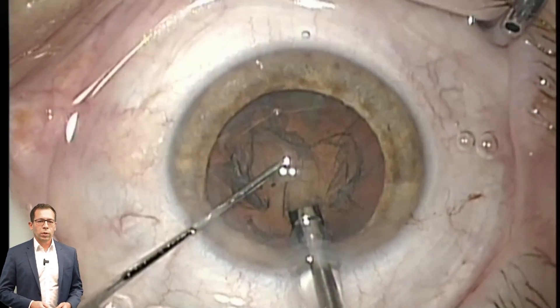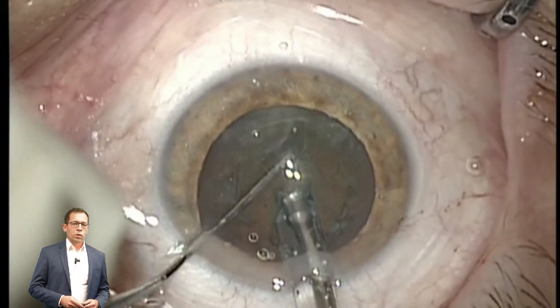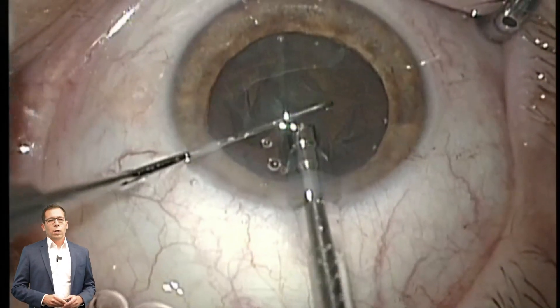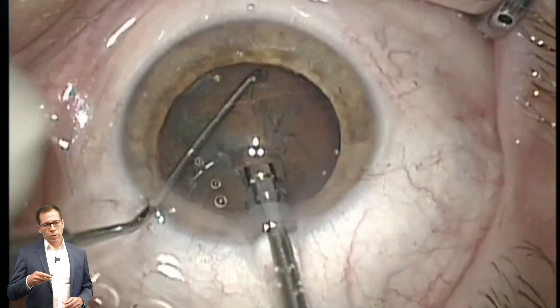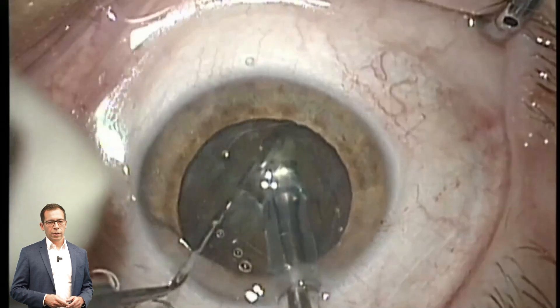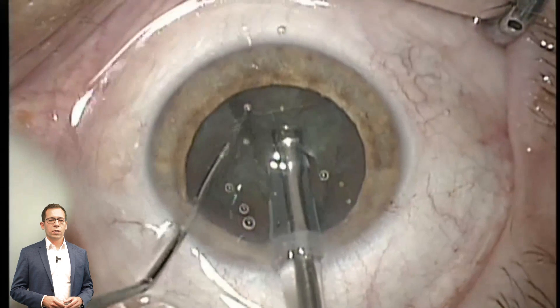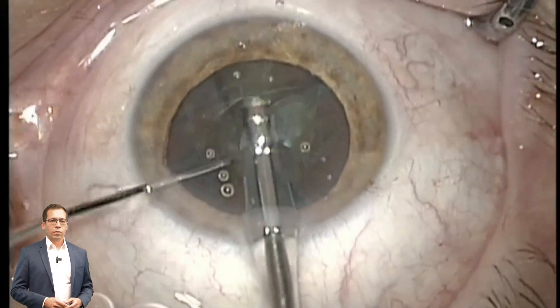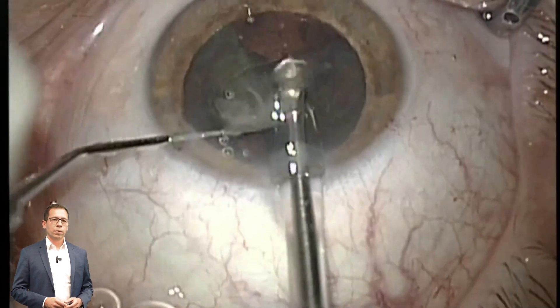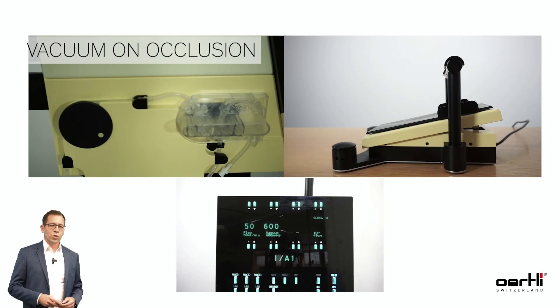This is a normal simple case of phacoemulsification using only the peristaltic pump. As you can see, it is a very controlled setting. You have a very stable anterior chamber and you always have to move the tip of the phaco needle to the lens to build up a vacuum. This is the big difference to the Venturi pump — you always have to have occlusion to build up a vacuum.